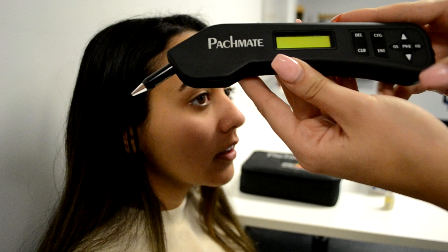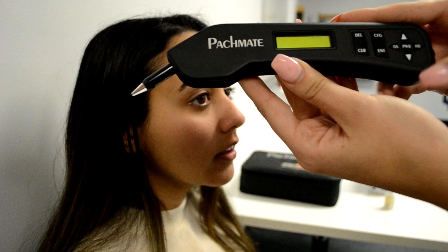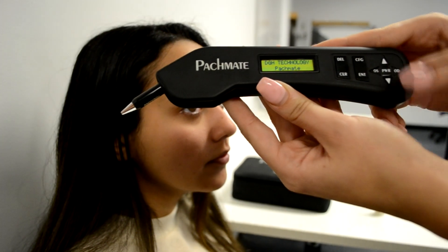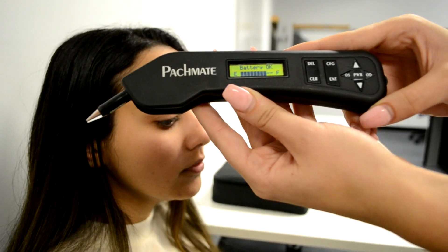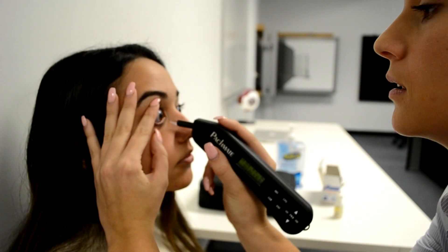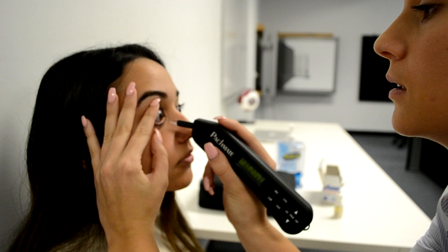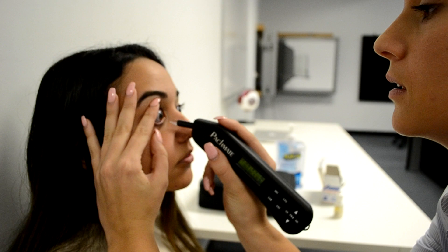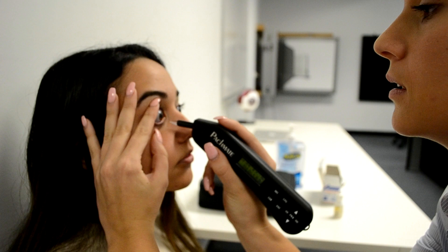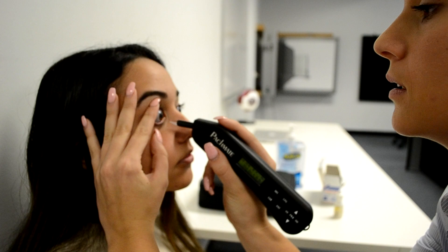You are now ready to begin aplanating. In clinic, it is standard to assess the right eye first. Aplanate by holding the pachymeter like a pen at a 90 degree angle to the cornea, ensuring that the flat tip is touching the patient's cornea. Remember not to apply too much pressure to the eye and do not move the probe while it is touching the cornea, as this may lead to a corneal abrasion. When the probe is properly aligned with the patient's cornea, the pachymeter will take measurements and you will hear continuous short beeps indicating each measurement has been taken, followed by two long beeps indicating all measurements have been taken successfully.